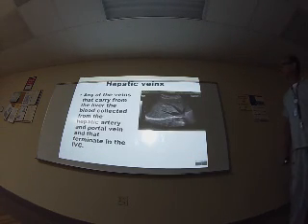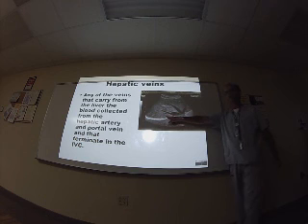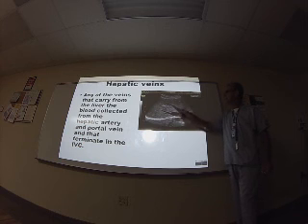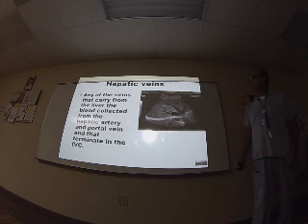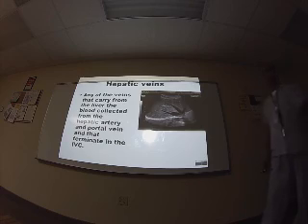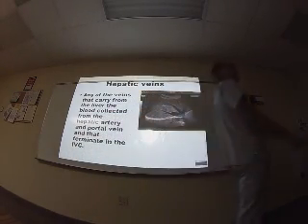Please, the confluence is a very important landmark. Another picture of the same. Hepatic veins: posterior, anterior, medial, and lateral. And the hepatic veins are the right hepatic vein, middle hepatic vein, and left hepatic vein. They are veins that carry from the liver the blood collected from the hepatic artery and portal vein and terminate in the IVC. This is true. Hepatic veins finish in the IVC.